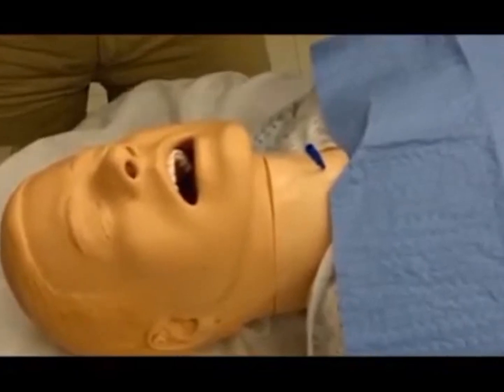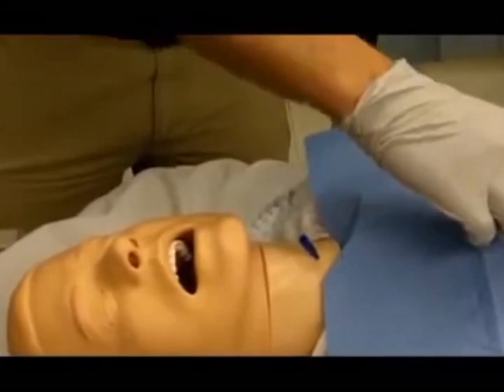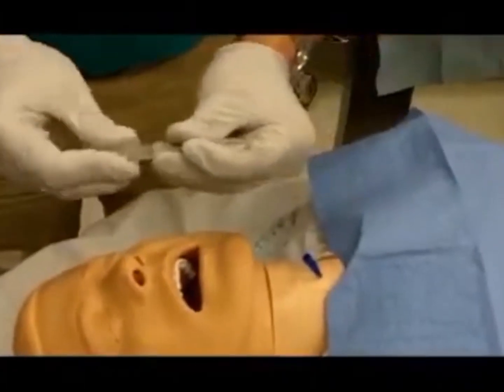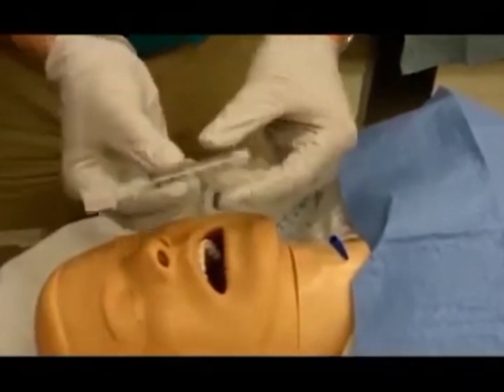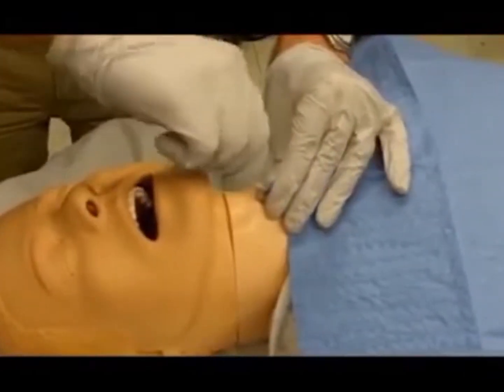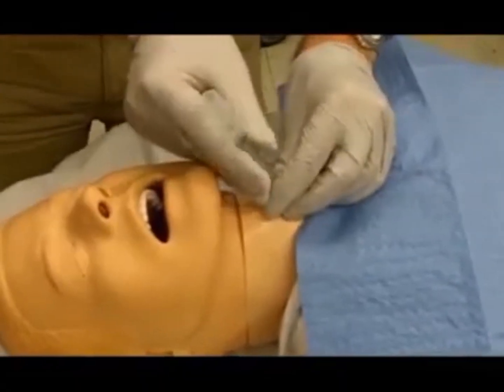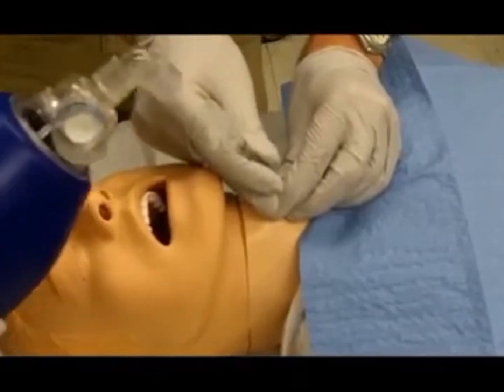Connect a 7.5 endotracheal tube connector to a 3 cc syringe with the plunger removed. Connect the 3 cc syringe to the catheter hub. Alternatively, one may use a 3.0 endotracheal tube connector to the catheter hub.